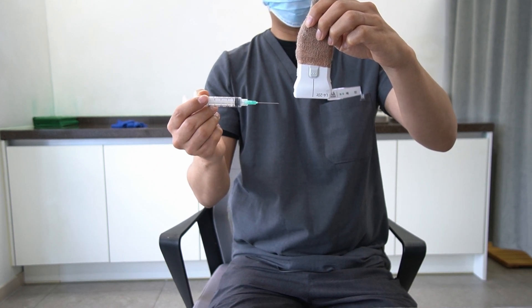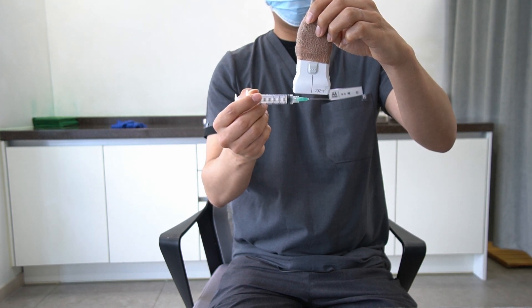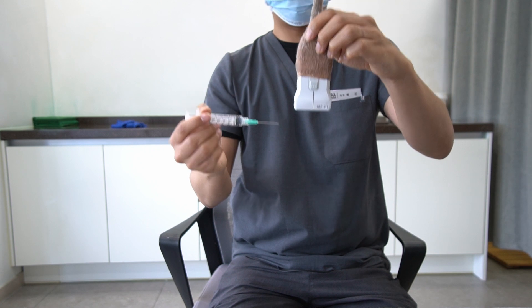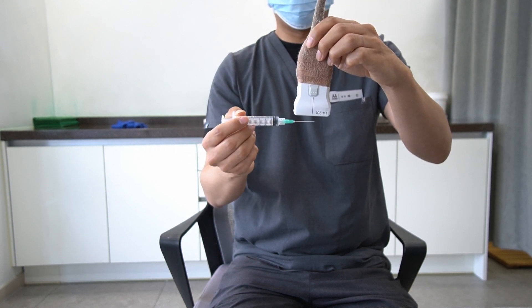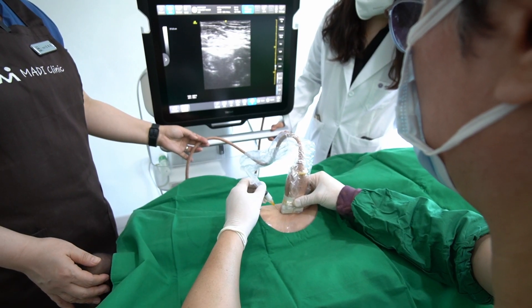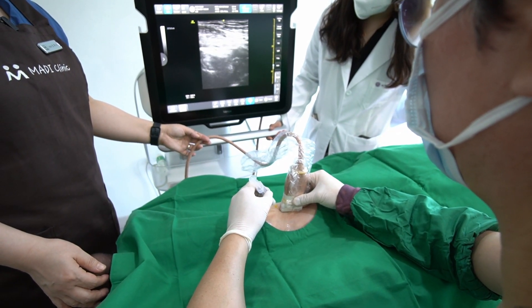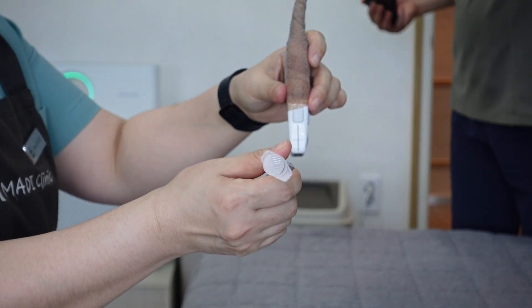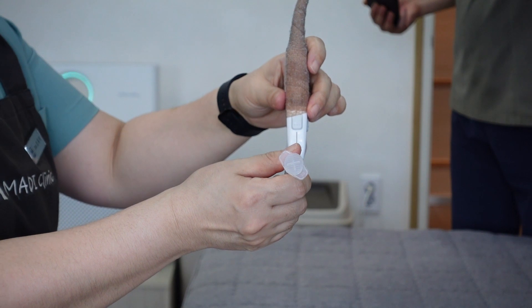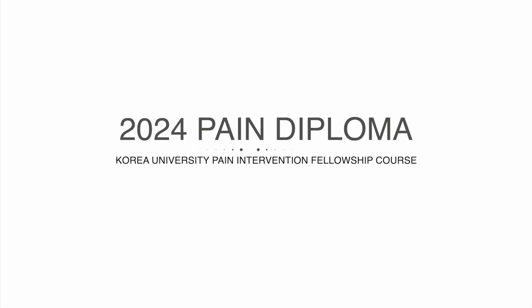In this exercise, I asked them to concentrate solely on managing the ultrasound probe and needle, not the ultrasound screen. We're investigating which method allows for the easiest task management and keeps the needle focused at the center of the ultrasound probe. Under typical circumstances, an ultrasound interventionist must simultaneously monitor the probe and the needle's direction and coordinate the needle with the ultrasound imaging screen. In this case, however, our focus is purely on probe and needle management.